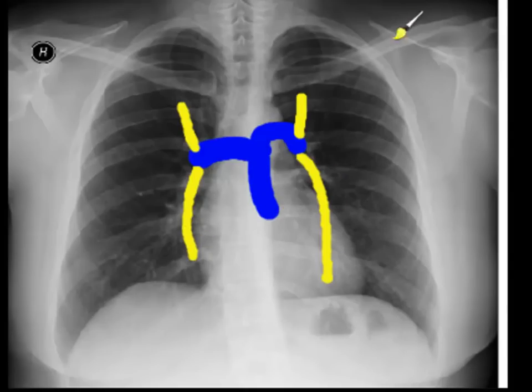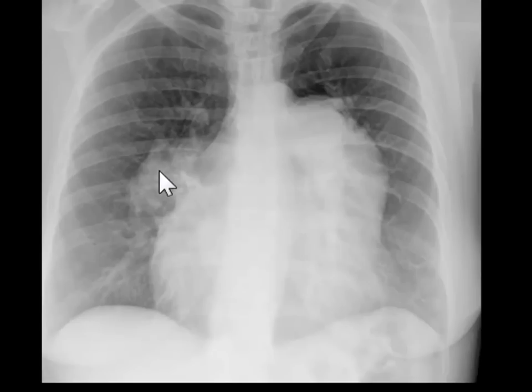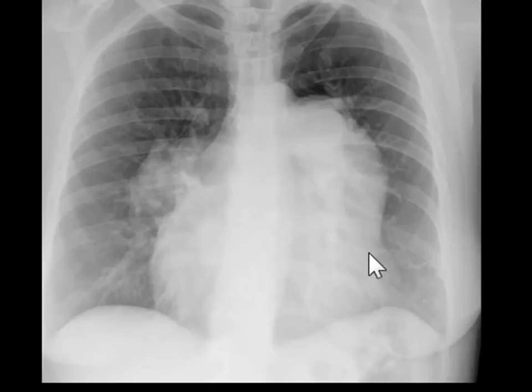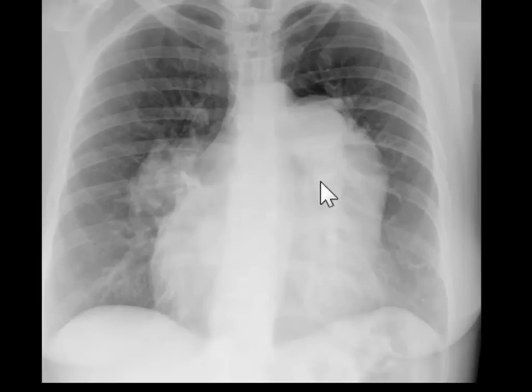We'll go back to the previous X-ray. This is the X-ray showing all the features of pulmonary artery hypertension. The anatomy: this is the right pulmonary artery, and this is the left pulmonary artery. This shadow is the main pulmonary artery, grossly dilated, and the interlobe branch is visible from behind the main pulmonary artery. We'll confirm our findings with the help of the CT scan that we have for this patient.